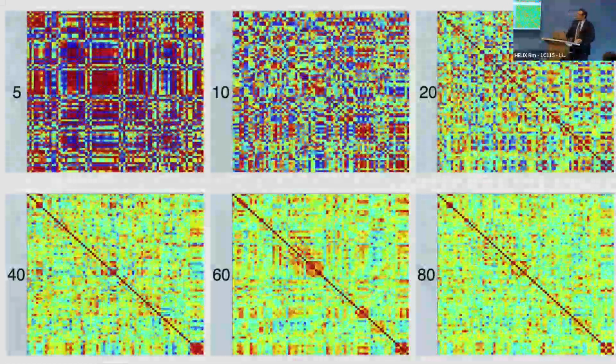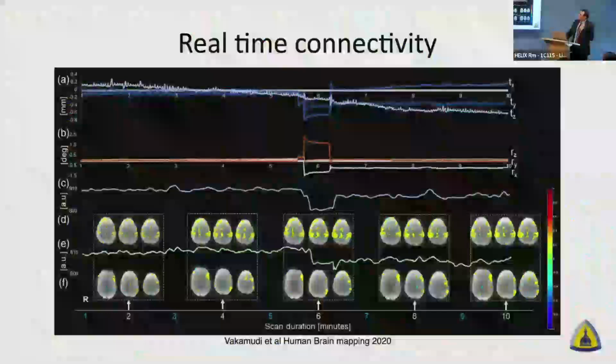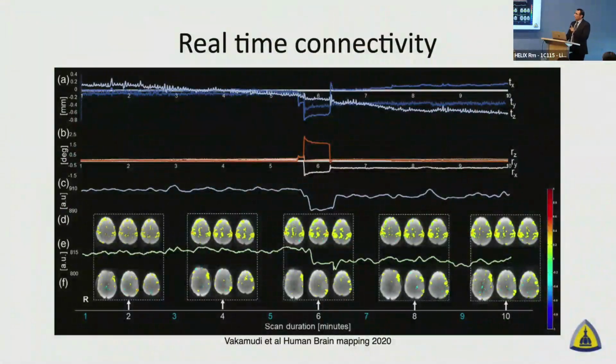And so we've got to try to figure out a way to deal with this. The language network, for example, doesn't show up very well all the time. And my suspicion is that the engagement is not as frequent in all patients as the motor network, for example, which shows up beautifully all the time. Some places tried doing this as well, and then they ended up doing a better job, so we stopped. You can actually put the person in the scanner and generate the networks in real time to see how they're coming and going and coming and going.